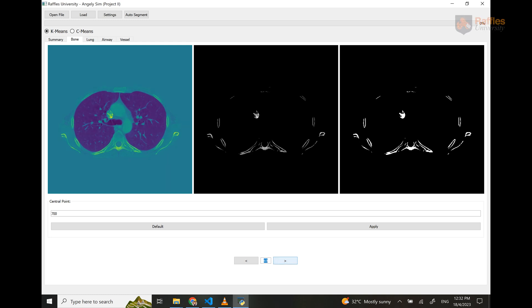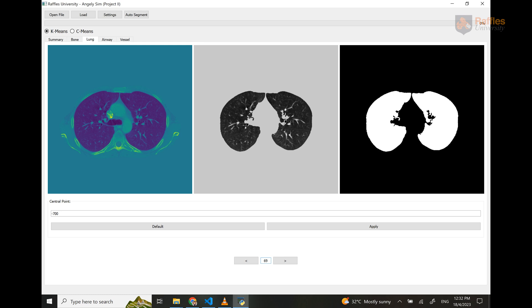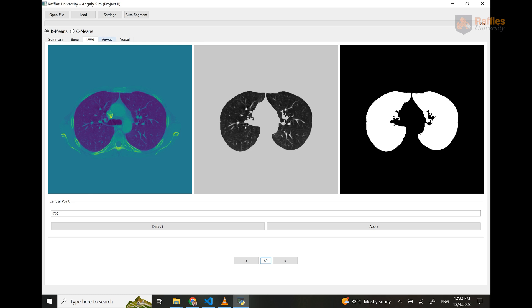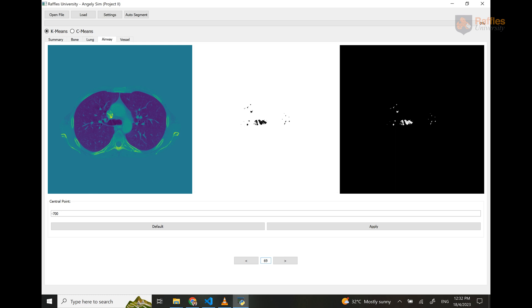This is the outlook for the lung tab, the vessels, and the airways.